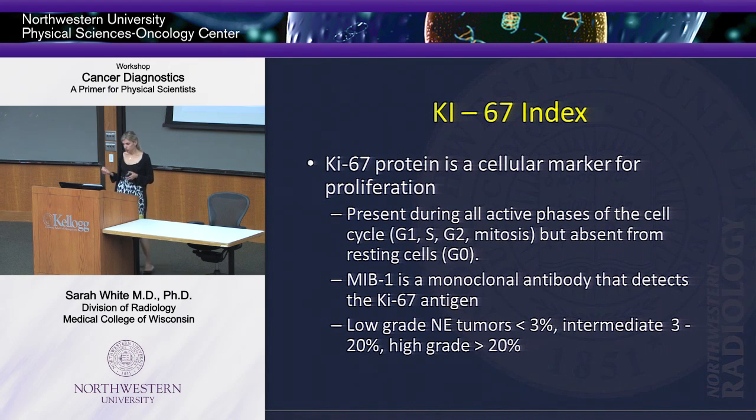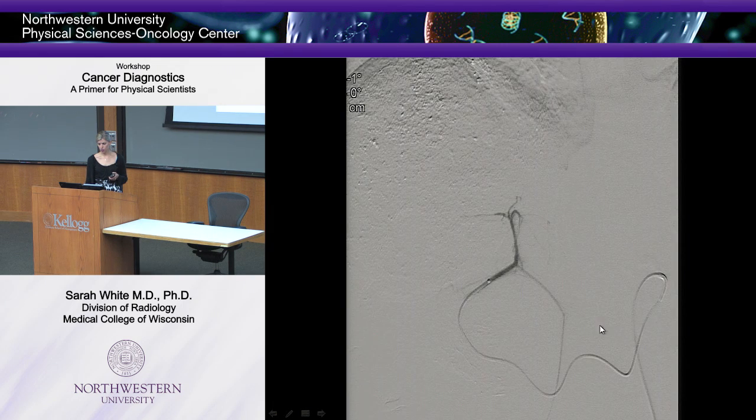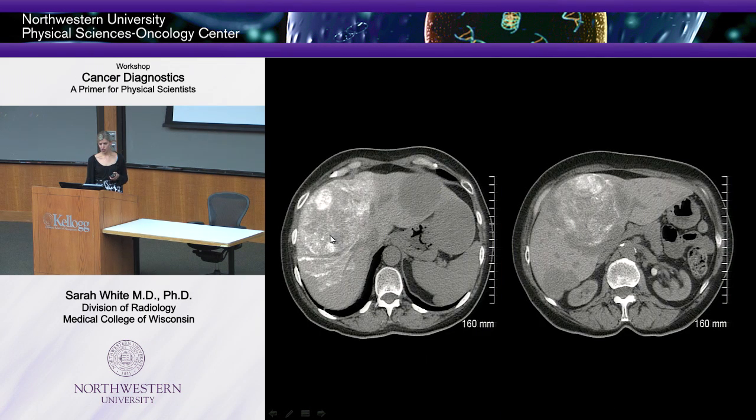So what did we decide to do? Well, what I'm good at. So we went in, and you can see this. This is probably one of the most beautiful images I think I've seen of a tumor. So it's on a stalk. This is the tumor. Okay, this is a second tumor. We injected our chemotherapy with our oil. Afterwards, you can sort of see how this looks grainy. We've got an uptake. There's no tumor blush left. This is our follow-up CT scan where we can see the Lipiodol has been taken up into the tumor.